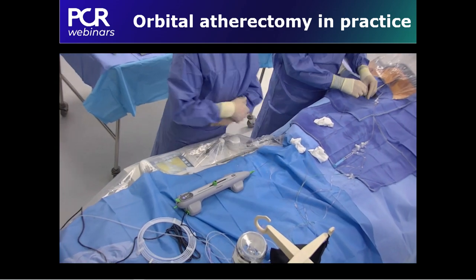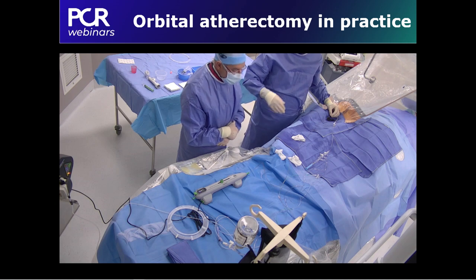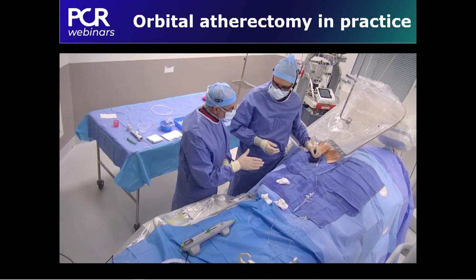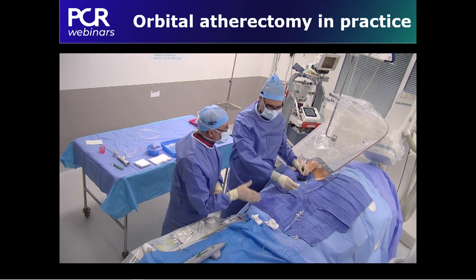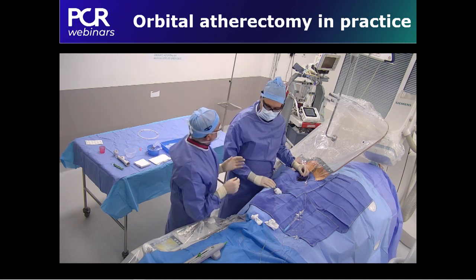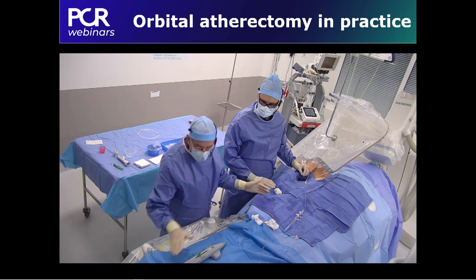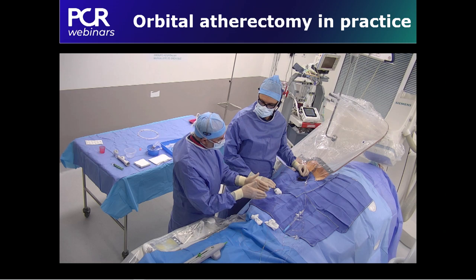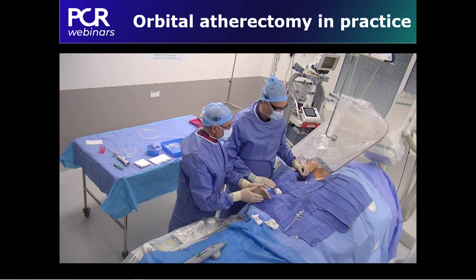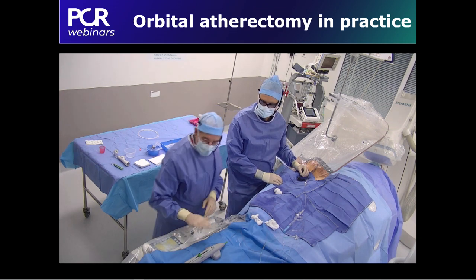So Jacques, to summarize, you have one low speed button for starting the procedure and small vessels, and the second button for large vessels, or to increase the sanding of your artery in case of larger vessels. Yes, very important. When we start the device, we always start with low speed. The low speed allows treating vessels from 2.5 millimeters to 3.5 millimeters, and the high speed allows treating 3.0 millimeter vessels to 4.0 millimeter vessels. But remember, we always start with the low speed. This is really important.